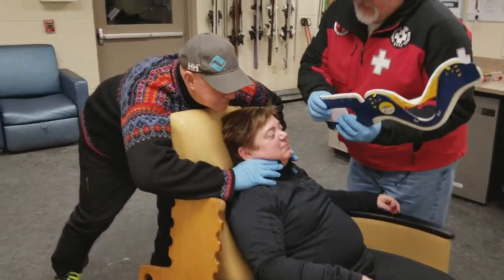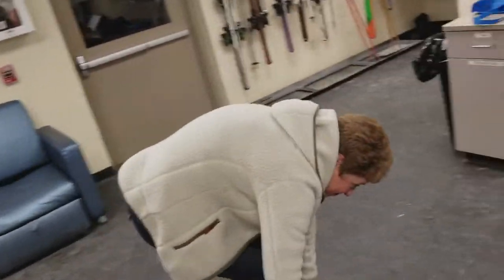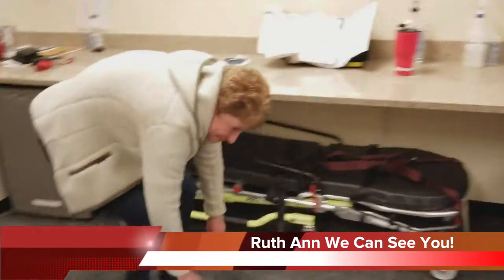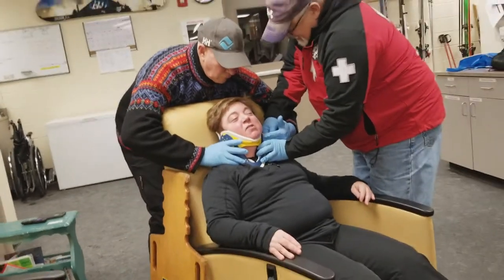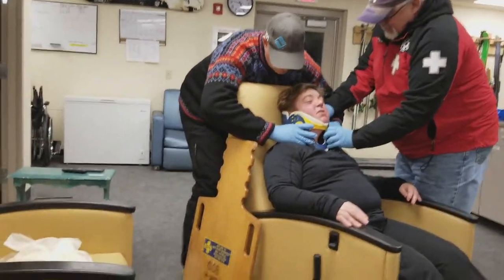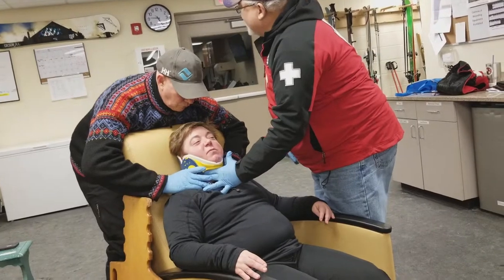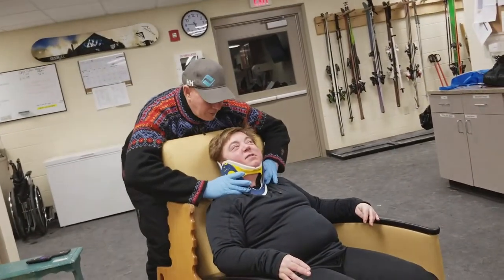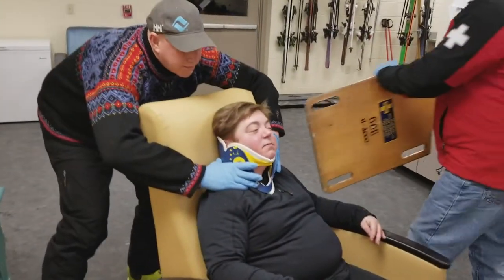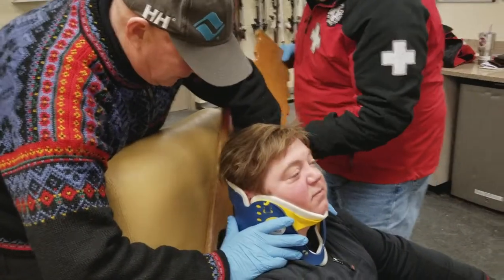So let me get this in. Okay. Yep, I'm definitely immobilized. You got it, John? Got it. All right. So what we're going to do is put this short board on you. I'm going to slide this in here — now we're going to do that without ripping up my sweater.